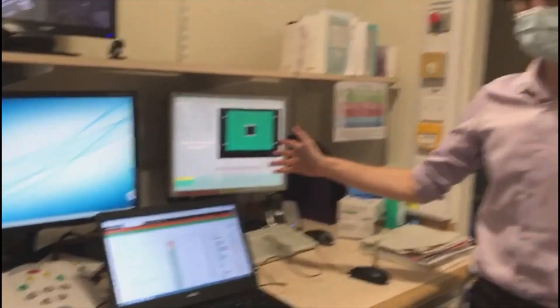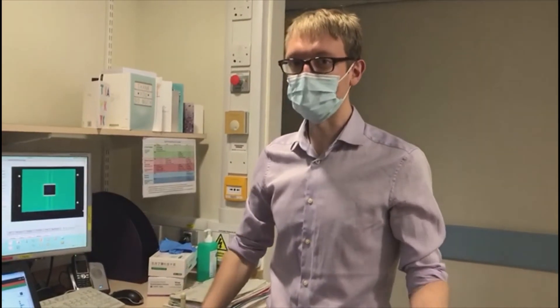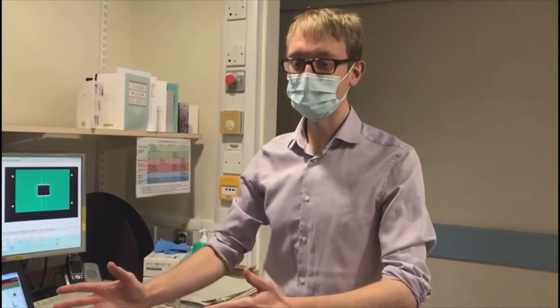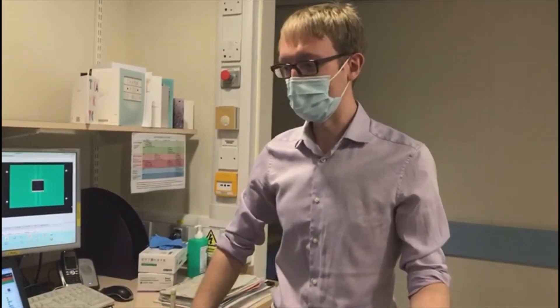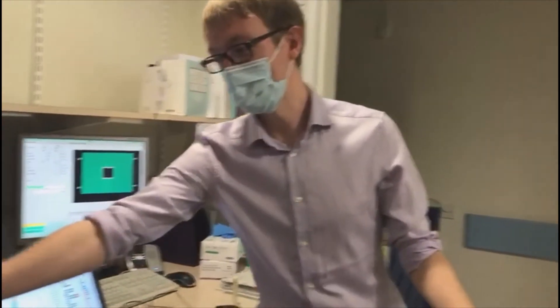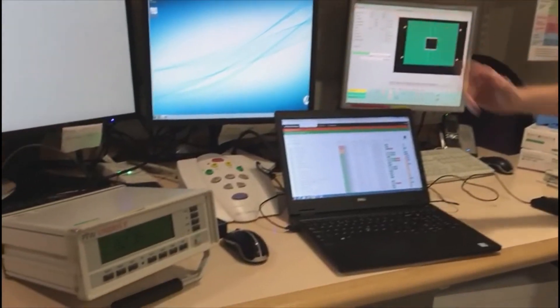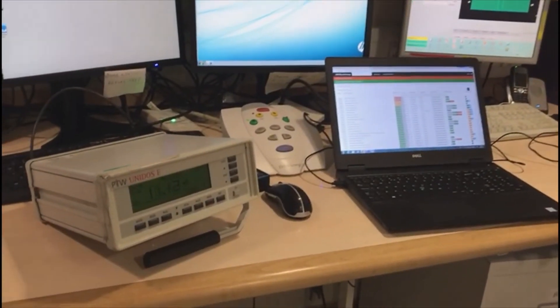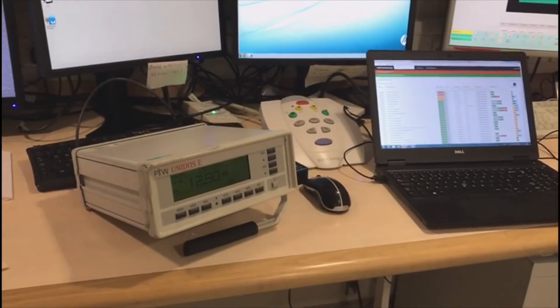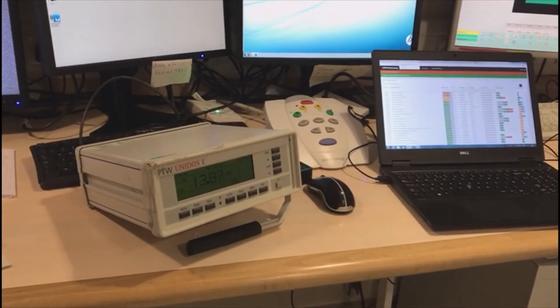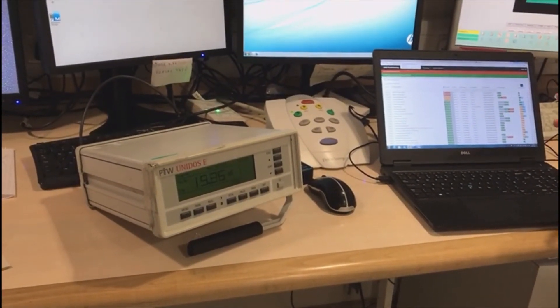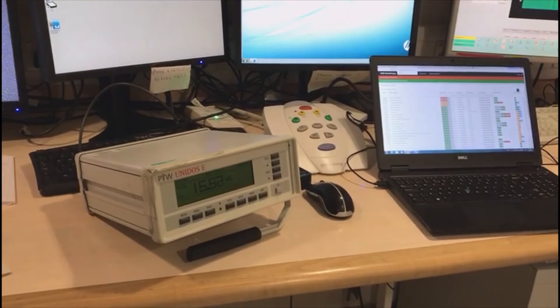I've told the machine to deliver a certain amount of radiation and now I'm using the electrometer here, which is connected to the chamber, to make sure that what I've told the machine to deliver is actually delivering in practice.